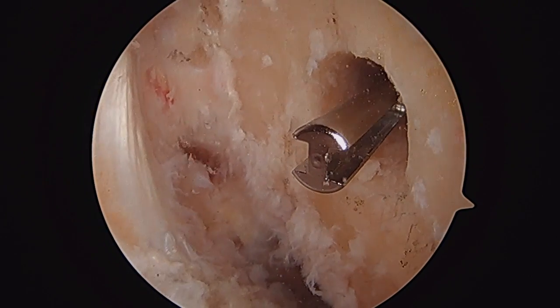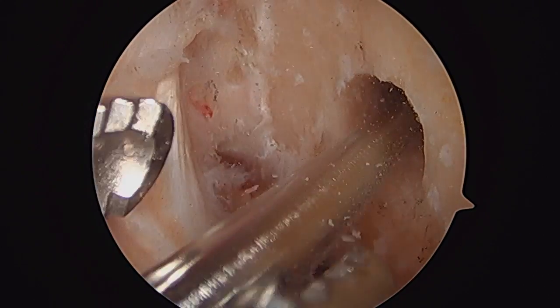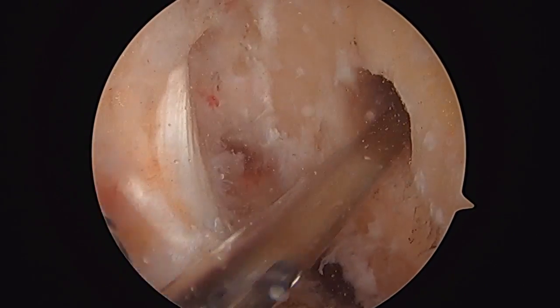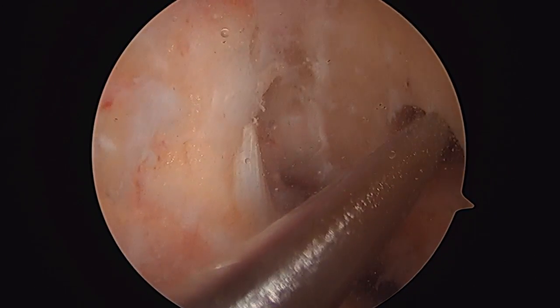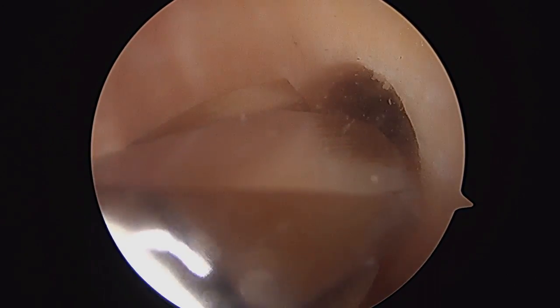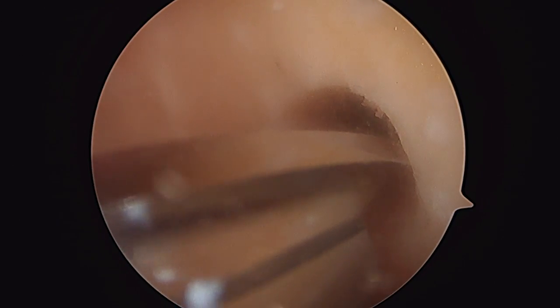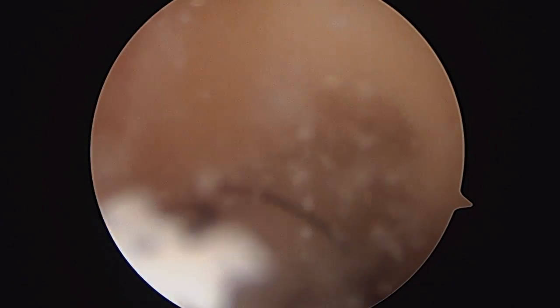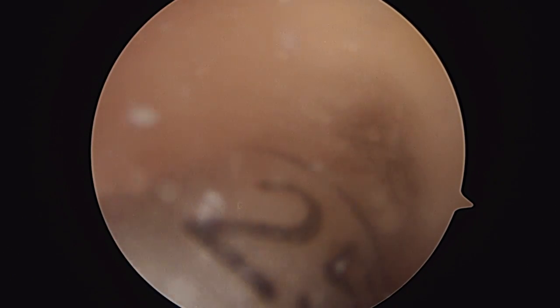So we bring the guide pin back down in the hole. It's been brought to the outside. We grab it with a grasper. It gets it out of the way to allow us to unflex the knee to check those landmarks. Pull that back out through the anteromedial portal, and here's the next size drill bit. So as you can see, I've hyperflexed the knee. I am asymmetric drilling. It's not drilling anteriorly and superiorly, it's drilling posteriorly and inferiorly.